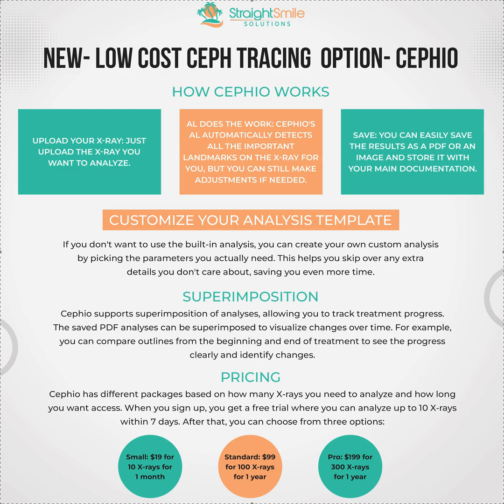No, I don't do Ceph tracing tutorials. That is the most tedious, annoying thing in the world, and I hate it. It's probably been 20 years since I traced a Ceph. Yes, we had to do them in residency. After we did so many, we were allowed to use Dolphin and some other types of software programs where we at least plot the points and they calculate the numbers, which is definitely more accurate. And then after that, we just would send them out. So I stopped doing that a long time ago.